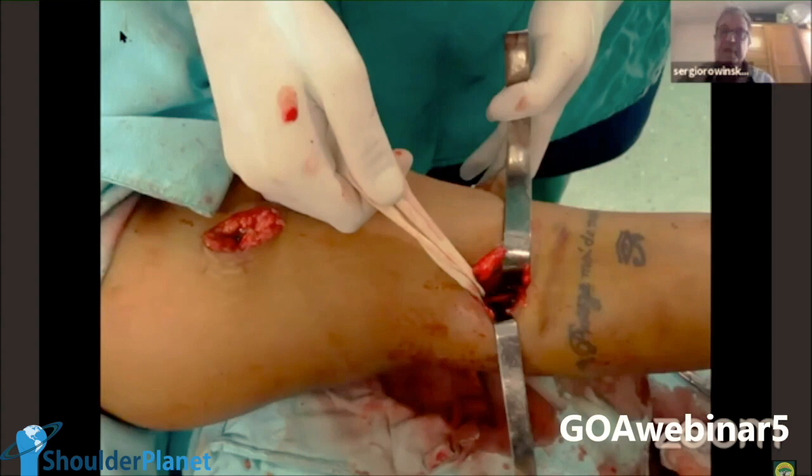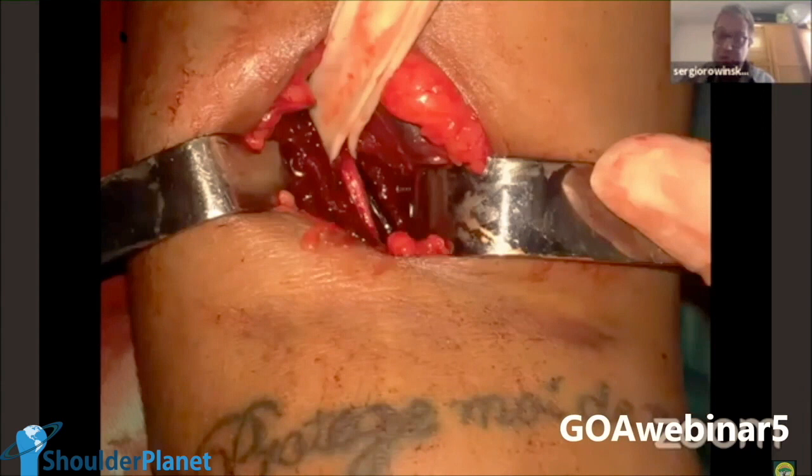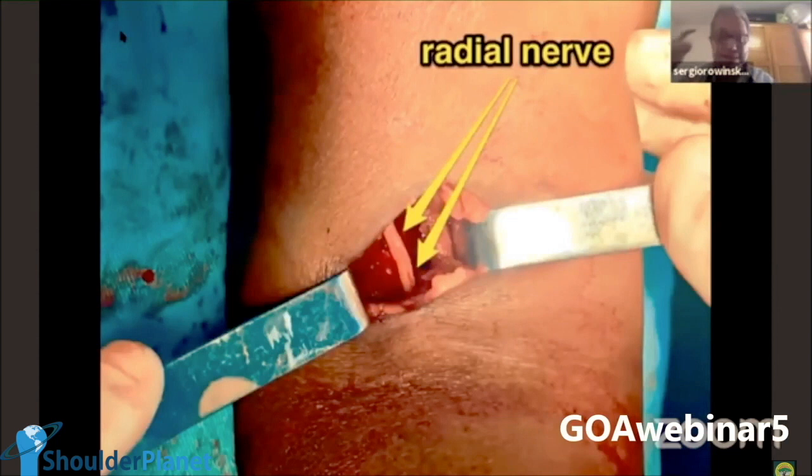This is another image of the radial nerve. You don't have to fear the nerve. You have to respect it. It's completely different. I learned this in the United States, in a fellowship with Snyder, and people taught me that. It changed my mind. It's a game changer.